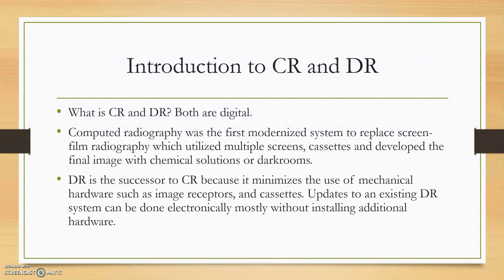In this period, other digital technologies were surfacing, such as FOV, which is a large field of view, X-ray phosphors, and optical lens to focus the X-ray to a narrowed CCD, which is another acronym for Charged Coupled Device Photodetector Panel. To clear up any confusion, a CCD is basically a light-sensitive circuit that stores data from the light in the form of pixels, which is then converted to an electric charge. CR is critiqued for having mechanical parts that wear down over time. DR doesn't have this, and CR doesn't save nearly as much time over traditional radiography as to the extent that DR goes.